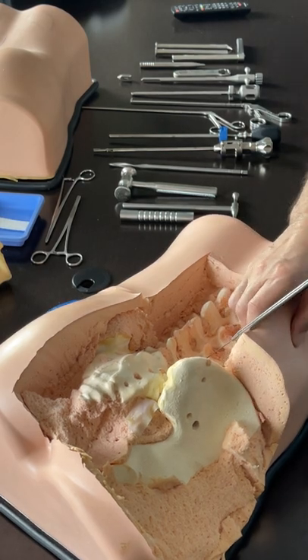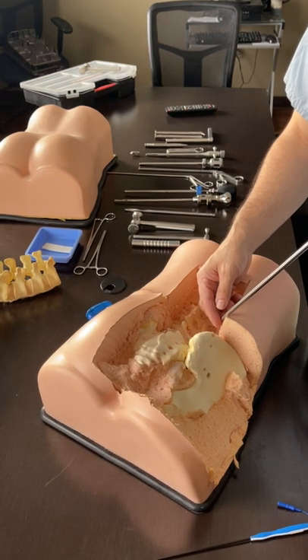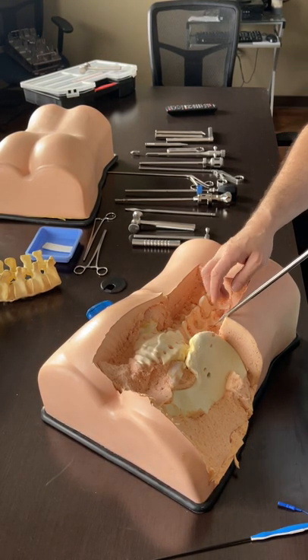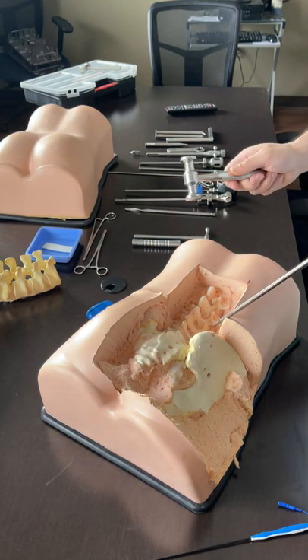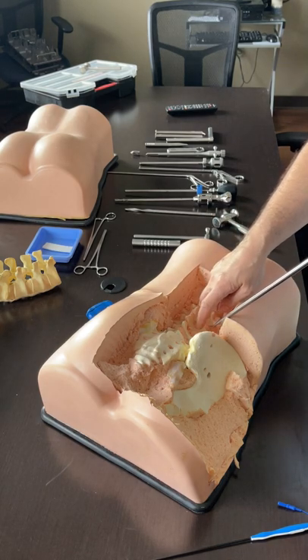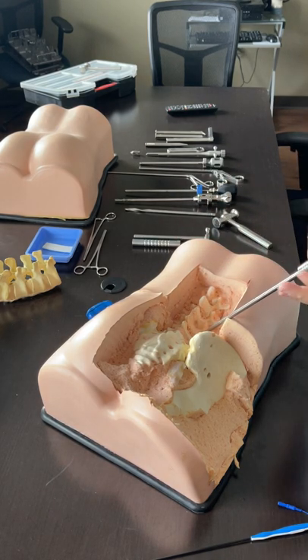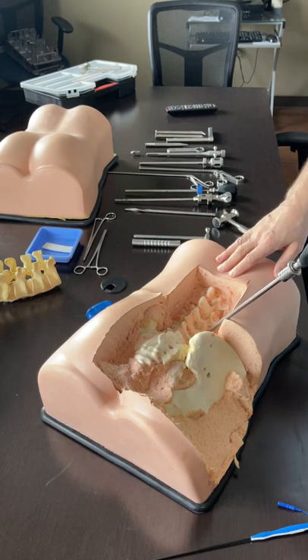What I do is take a hammer and just hammer it through the fascia, or cut a slit. Don't fight the fascia, otherwise you may bend the K-wire and have to start all over. Then I massage it like this, roll it in, and go to Kambin's triangle.